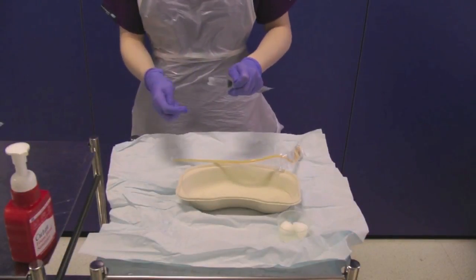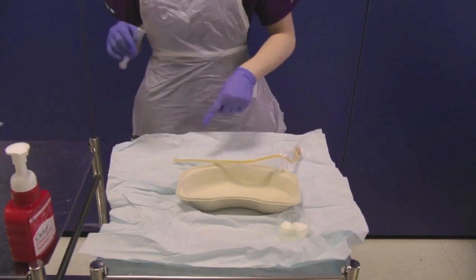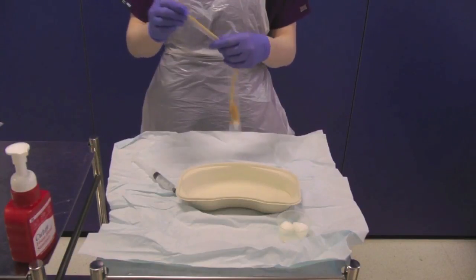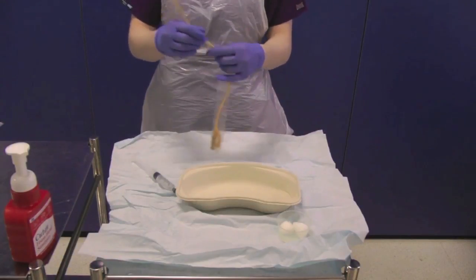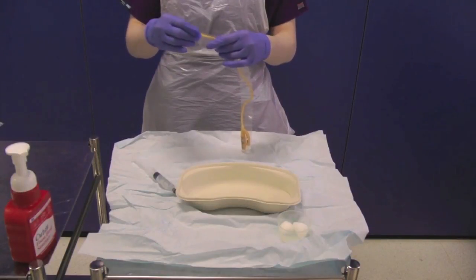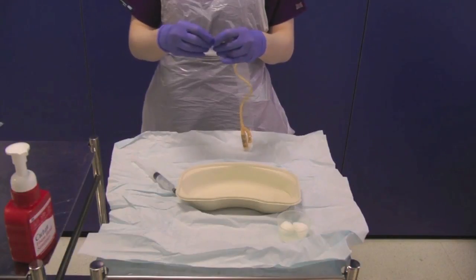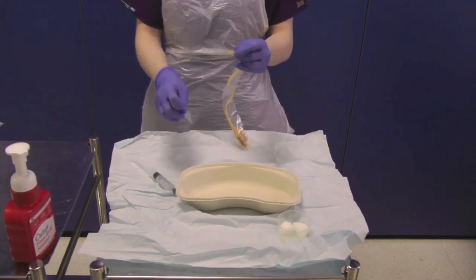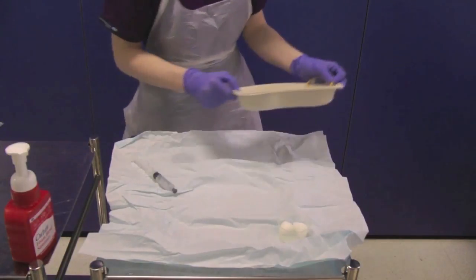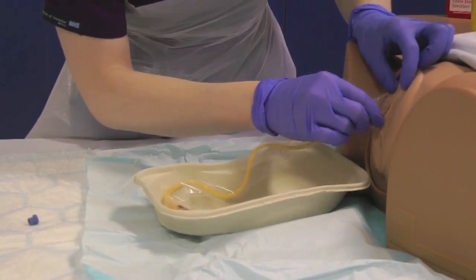Open the 10ml syringe from its sterile packaging and leave this on your sterile field. Open the urinary catheter from its sterile packaging using the perforations to help you, exposing the catheter tip only. Hold this in the sterile J tray and place onto the bed between the patient's legs.